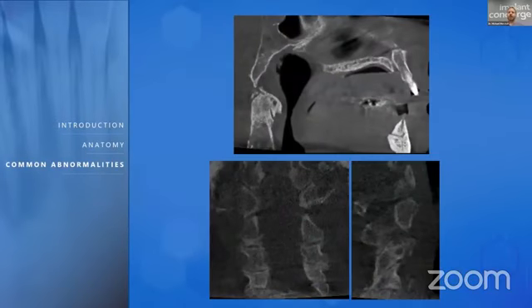So just like the other joints that you have in your oral maxillofacial region, you have to also include your cervical vertebrae, because as you can see here, it doesn't work the exact same as your condyle, but the osseous changes are going to be very similar. In this case, with your cervical vertebrae, you're still going to have those subchondral cysts. You're still going to have the osteophyte formation, but you also potentially have calcification of the ligaments.